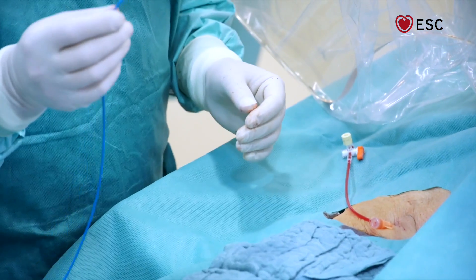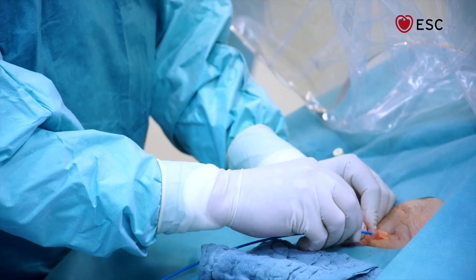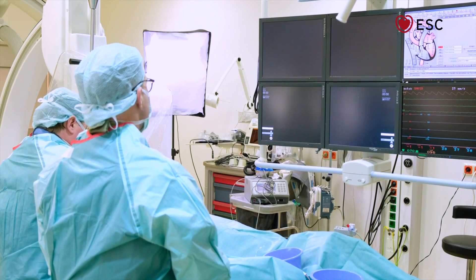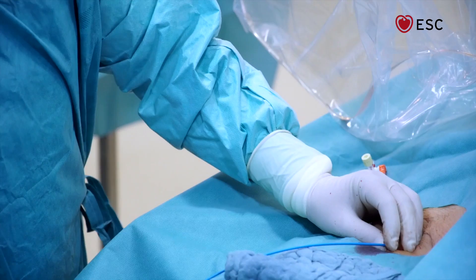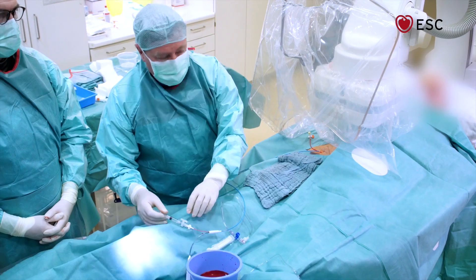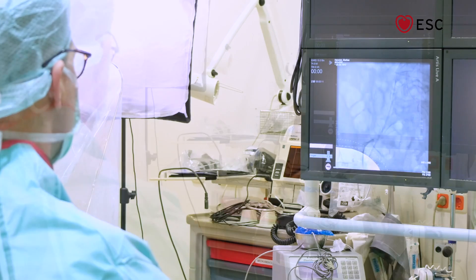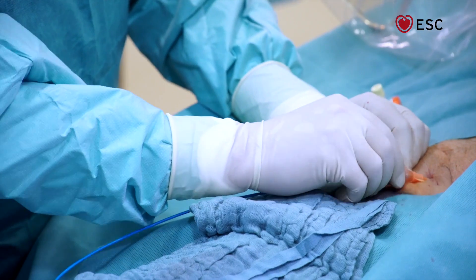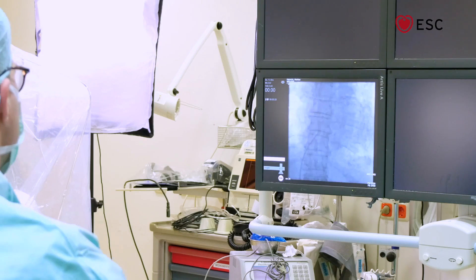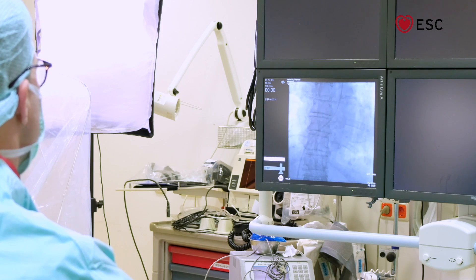Now we insert the single-lumen catheter into the sheath and push it forward. We can use fluoroscopy to see where we are. Now the catheter is in the vessel, and in this position we blow up the balloon. Then I push the catheter further in through the inferior vena cava, through the right atrium and the right ventricle, hopefully directly into the pulmonary artery.